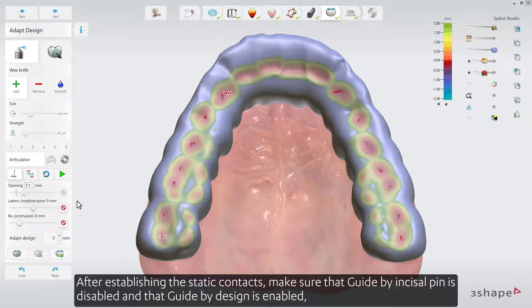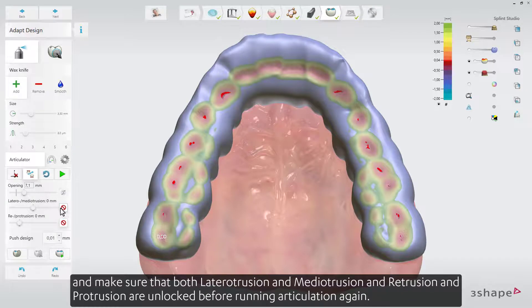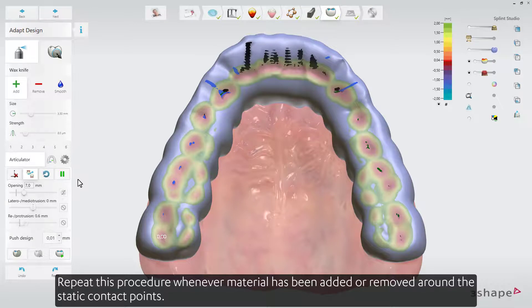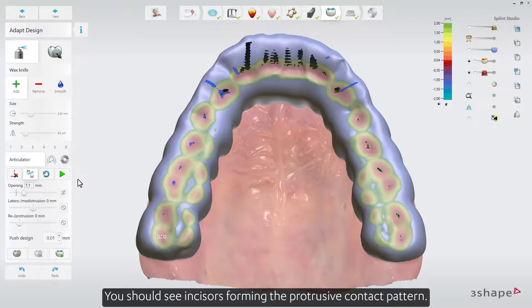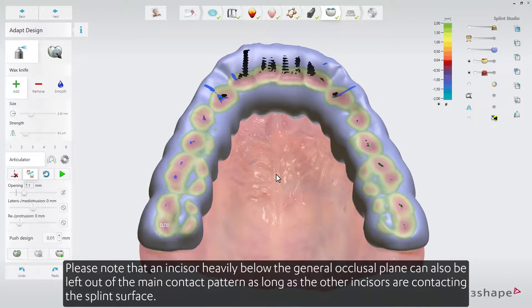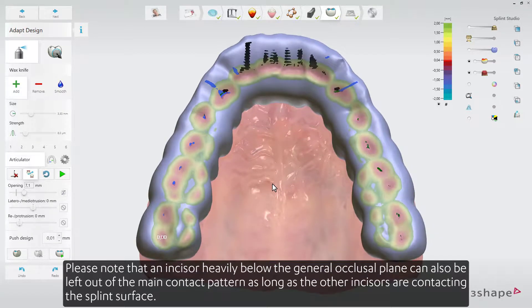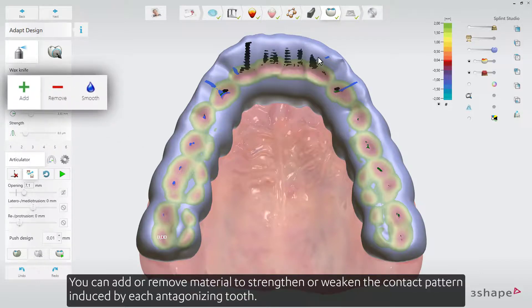After establishing the static contacts, make sure that Guide by Incisal Pin is disabled and that Guide by Design is enabled. Make sure that both Lateral-Otrusion and Medi-Otrusion and Retrusion and Protrusion are unlocked before running articulation again. Repeat this procedure whenever material has been added or removed around the static contact points. You should see incisors forming the protrusive contact pattern. Note that an incisor heavily below the general occlusal plane can also be left out of the main contact pattern, as long as the other incisors are contacting the splint surface. You can add or remove material to strengthen or weaken the contact pattern induced by each antagonizing tooth.